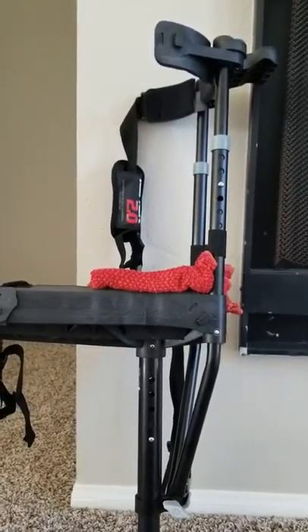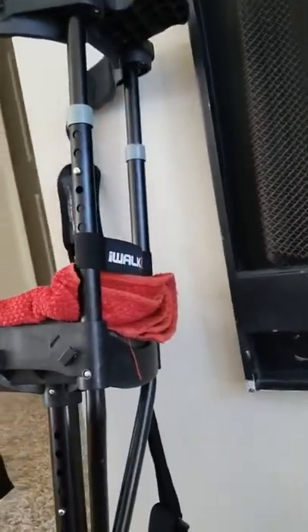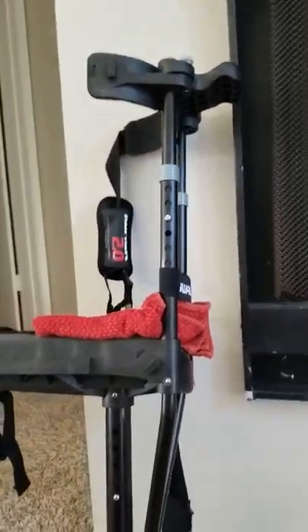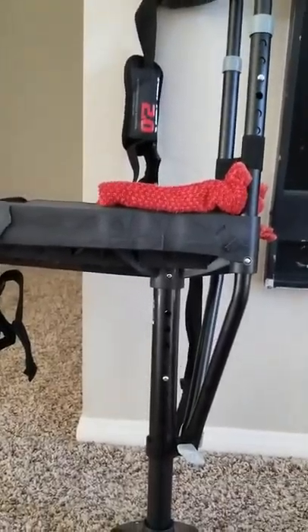This is the iWALK 2.0, and right now there's no way I would be living without this thing. This is one of the best inventions ever. If you have sprained your ankle, broken it, or whatever — you can't get around — it's great.